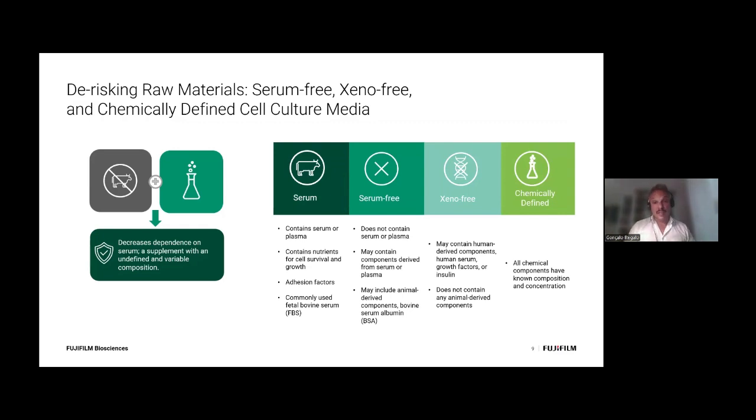So one thing that very clearly, very early in the process, for those of you out there looking at making or developing a cellular therapy, one very early step that needs to be taken into consideration is to try to de-risk those raw materials, resorting to either serum-free, animal-free, xeno-free media formulations, or ideally a chemically defined cell culture media where all elements of that media are defined, which assures reproducibility in terms of the raw materials of that process, and the biology that one needs to achieve at a certain process step, right?